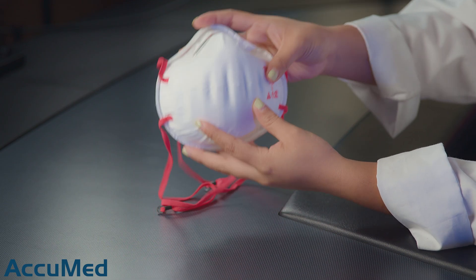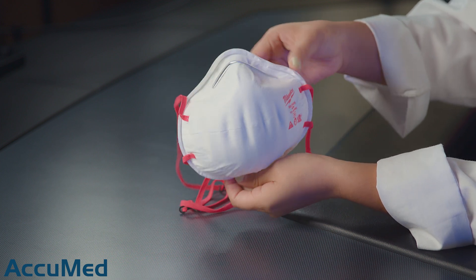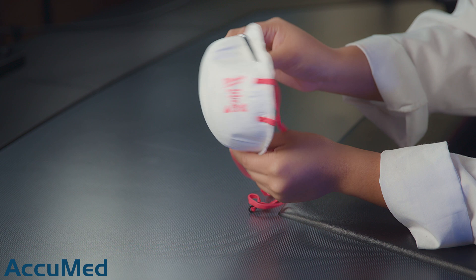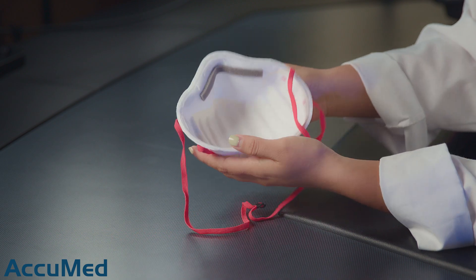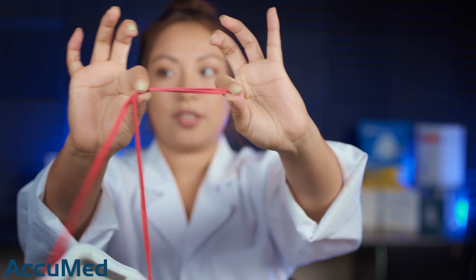These are the exact same thing as the other ones that we reviewed except for the valve not being there. They are a stiff cup style respirator. They have all of their markings on the side, the nose wire on top, and they have the nose foam. The straps are very long but they have a small black bead where you can just adjust it to your liking.